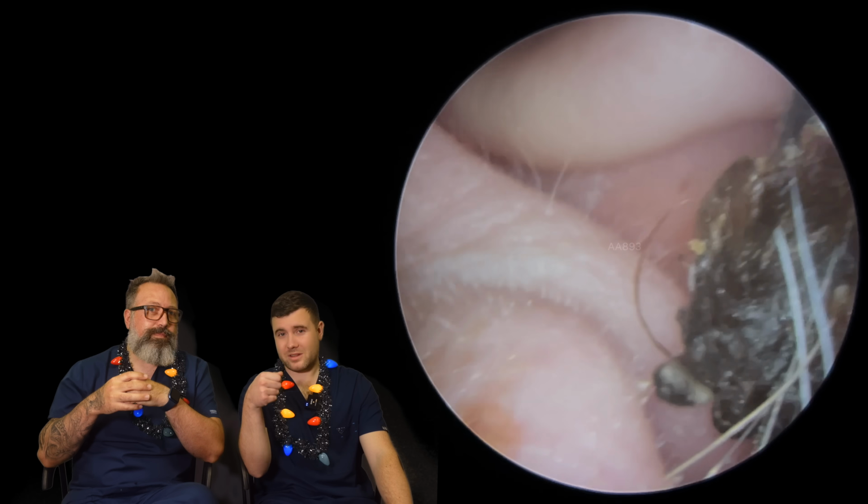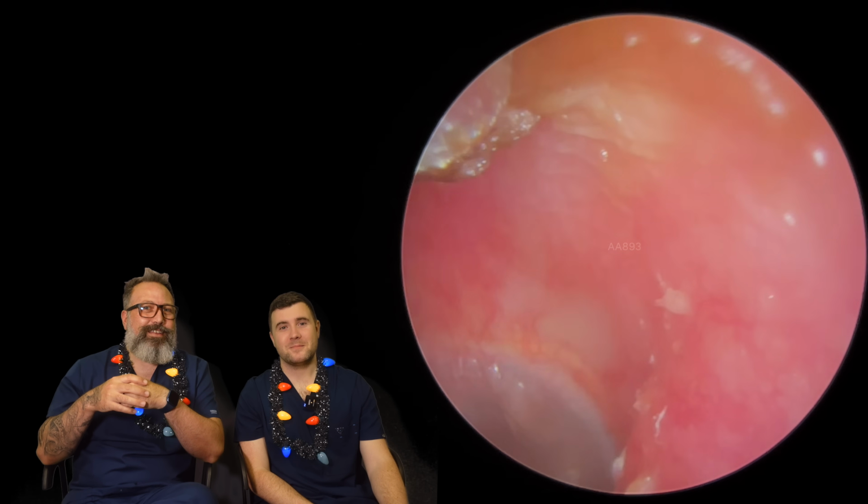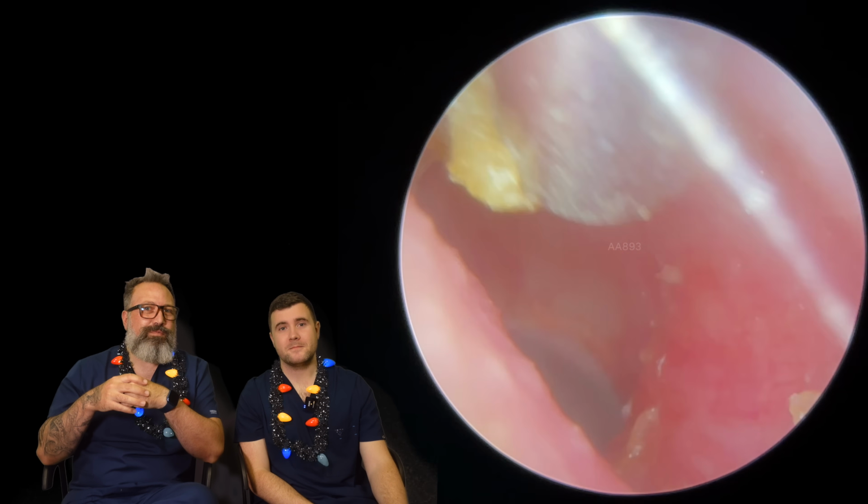Do you have to get one of us to hold the ear open? Not on that one. I have done in the past, but not on that one. I think I just had enough room to push it open to one side.